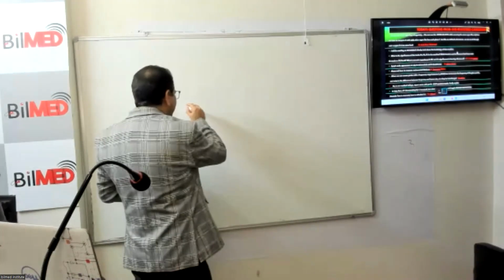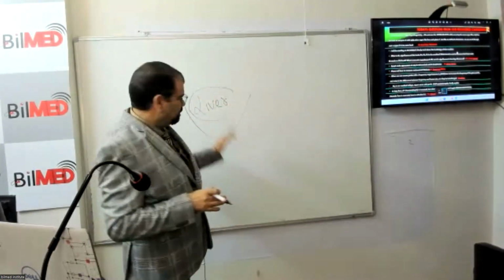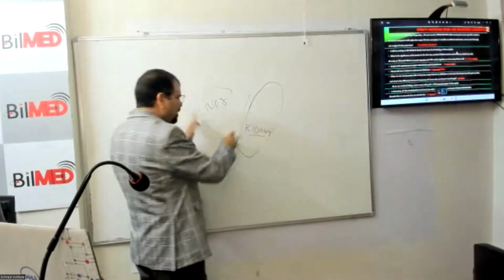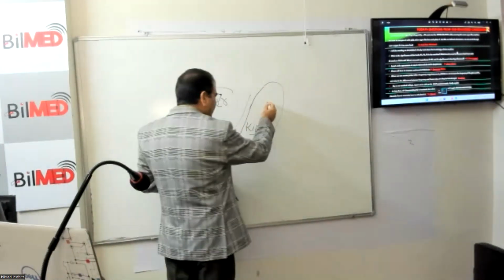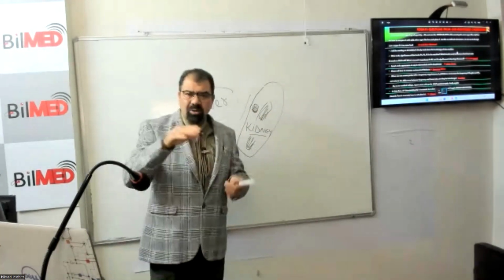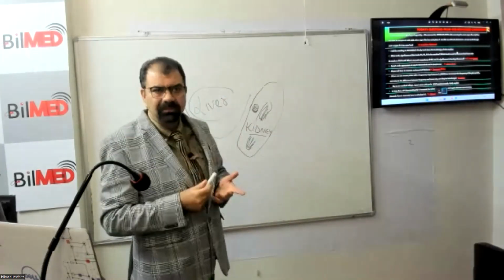Like I am having a liver over here. For example, I am having a liver. When I am comparing the overall echogenicity of the liver, overall echogenicity, mind my words, then my scale is over here, and that is the kidney. So when I am comparing the overall echogenicity of an organ, then I have to compare it with the adjacent organ. Like in kidney, we know that there is the central part. Central part is more echogenic than the peripheral part. So to say whether this kidney cortex is having less echogenicity, more echogenicity? I will not discuss all over here because this is already covered. So the answer is that when I have to compare the overall echogenicity of the liver, I have to use the adjacent organ, but not always.